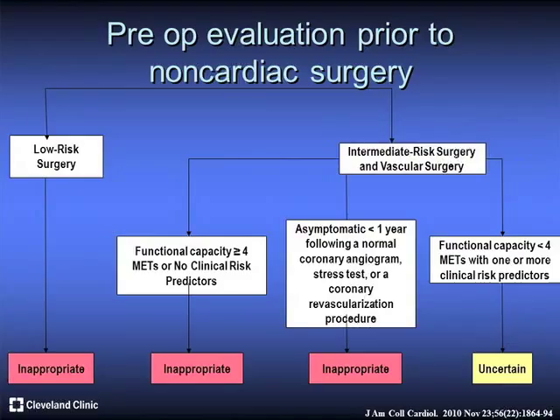Non-cardiac surgery, I'm sure you guys deal with this a lot. Impact center, people who work in the impact center, according to this, basically there are no definite guidelines, or there are no indications where CT angio is considered appropriate. This is more than likely to change in the future with more availability of data, but essentially a lot of stress testing we do is inappropriate in those patients. CT angio for sure is also considered inappropriate.